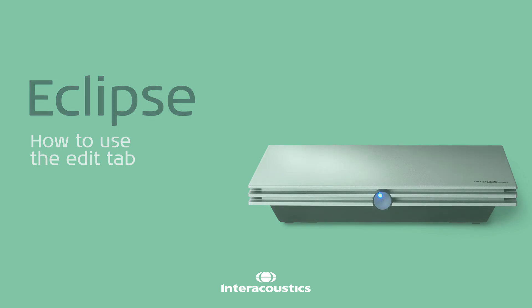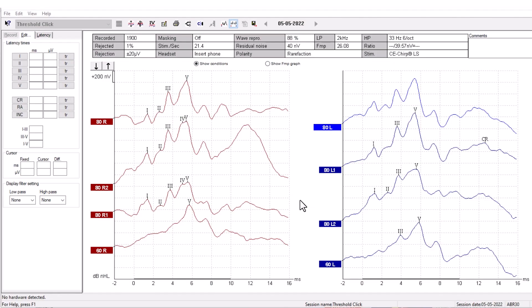How to use the Edit tab. This is how you use the Edit tab in the Eclipse software. First, click the Edit tab next to Recording, and you'll see this window here to the left.